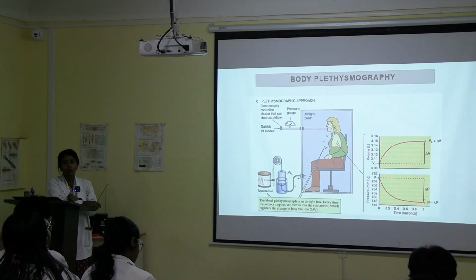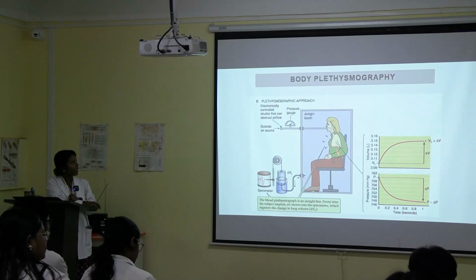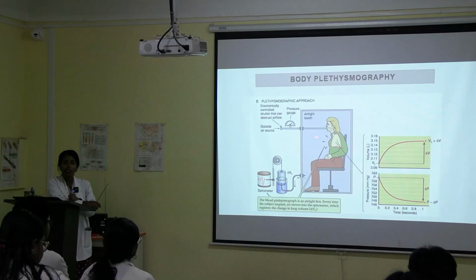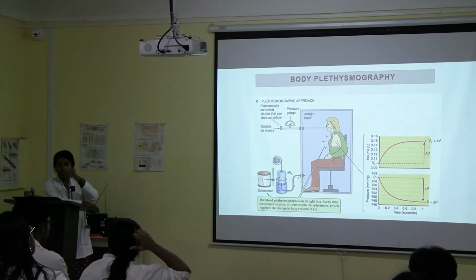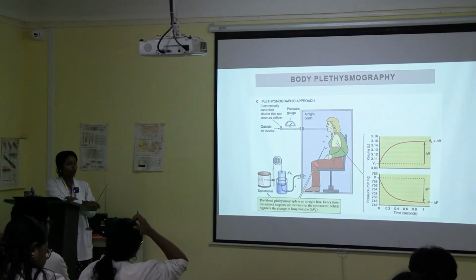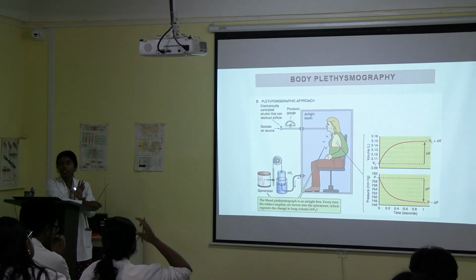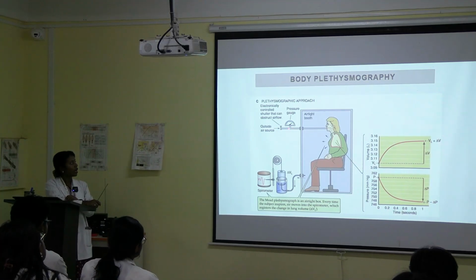Another is body plethysmography. Here the person will be sitting in a chamber. You have seen the telephone booth chamber, made of glass. The person will be sitting in a chamber that is made of glass, that is airtight, and will be connected to an outside source.